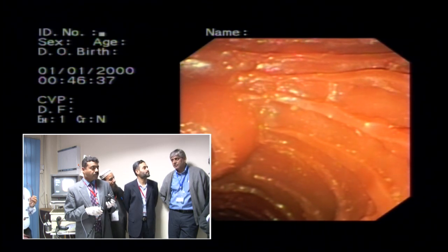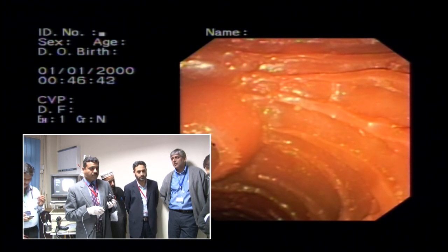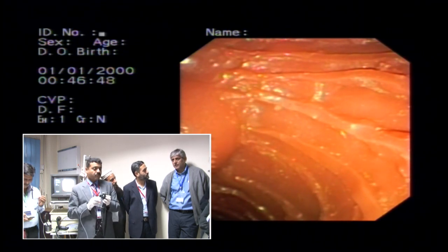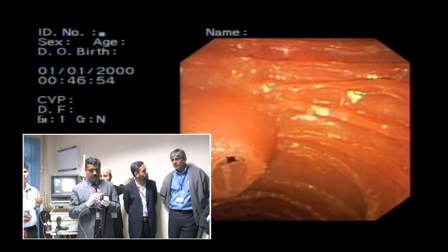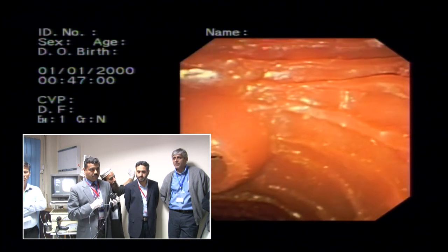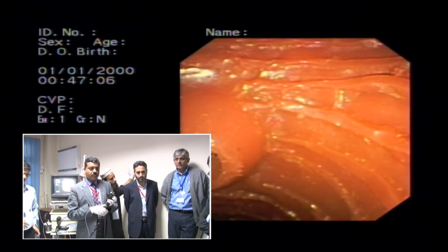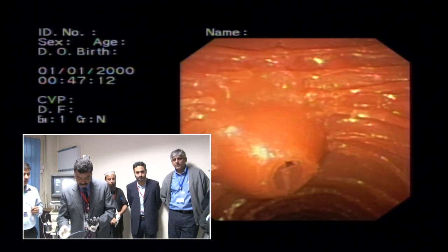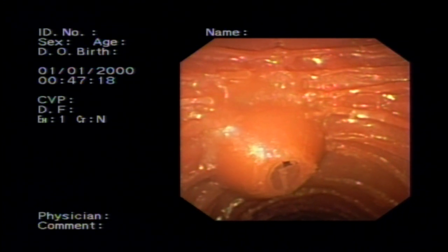Again, if you can't see, I mean, obviously, I can't overemphasize the position that you have on the screen. Check the position on the screen. If you can't see the tumor involvement and you're not sure, look at your position and then you'll probably find out. You get the right position and then you can sometimes even blindly get into the duct. If the position is not right, then it doesn't work. So you can do that and let's just go through the first round of movement and then what we do is we just tense them.